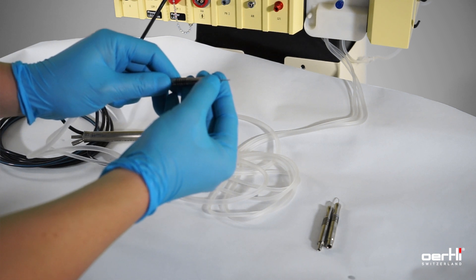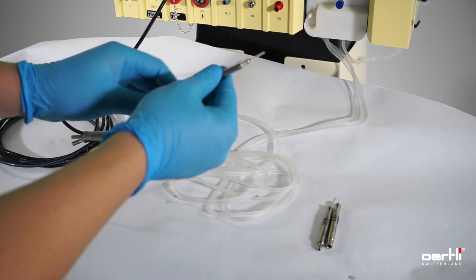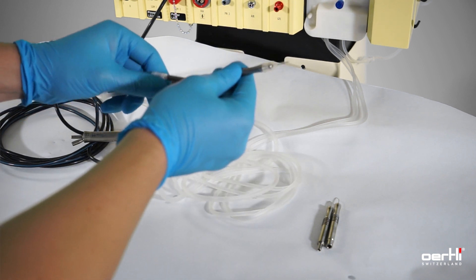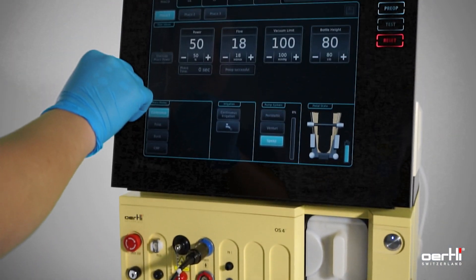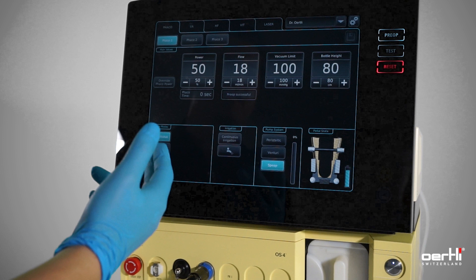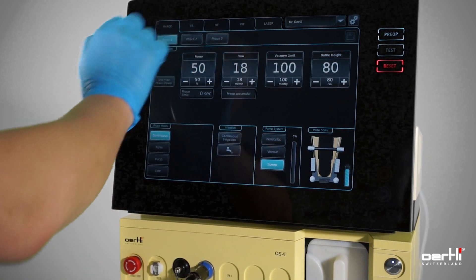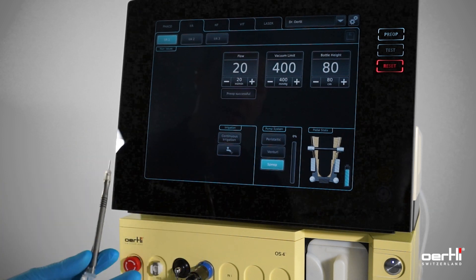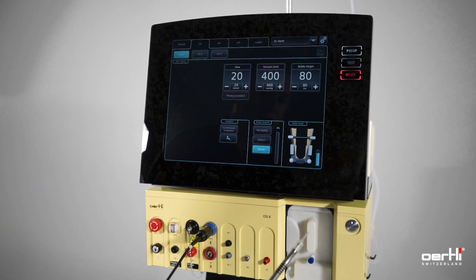Final step, attach the sleeve and then switch to IA function on the device. For visual reasons, we now remove the sterile back, press IA, hand over the IA handpiece to the surgeon and continue with the surgery.